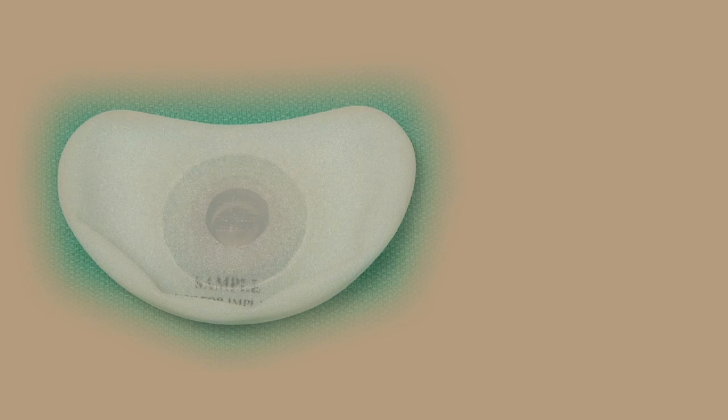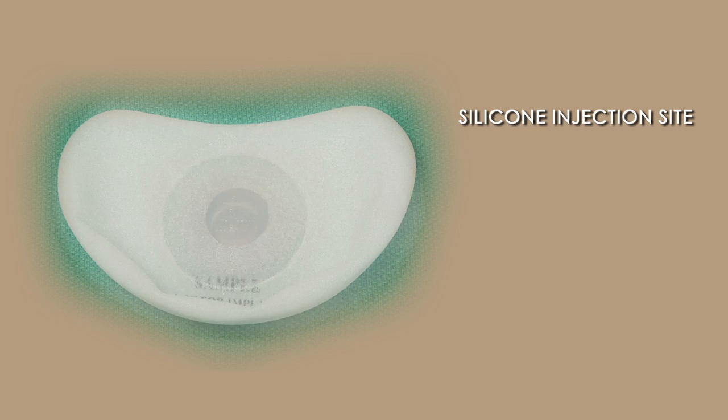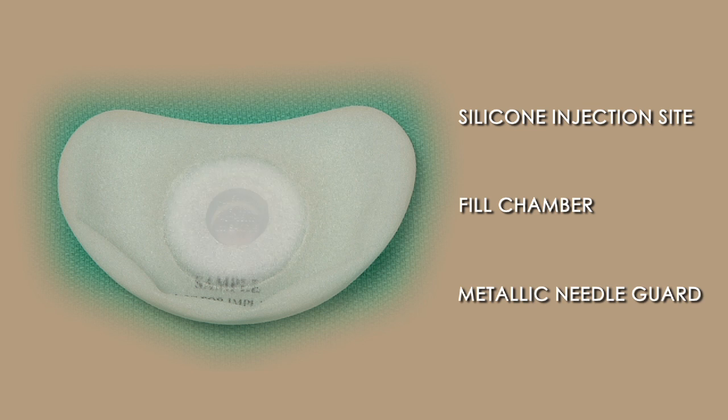Essentially a tissue expander is a saline-filled implant with a built-in port-a-cath. The silicone injection site self-seals. Deep to this is a reservoir and a metallic end plate which prevents the injection needle from going through the back of the tissue expander.